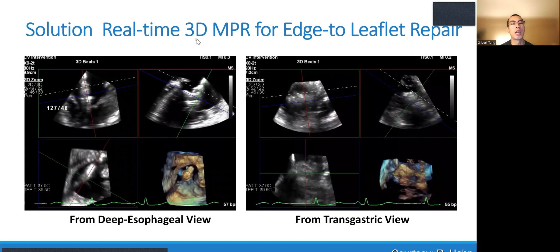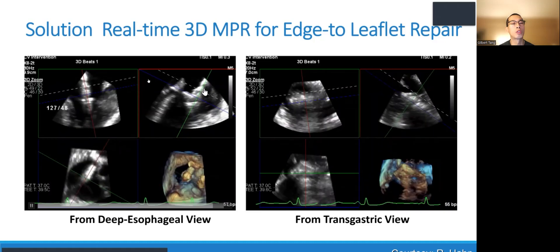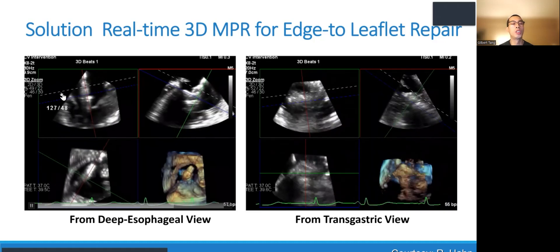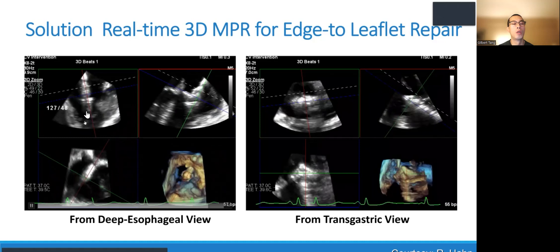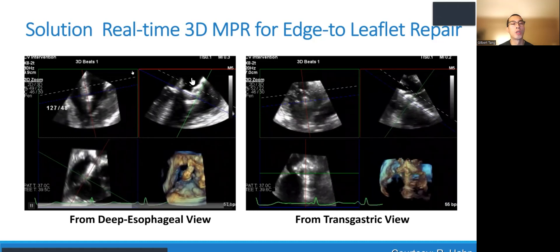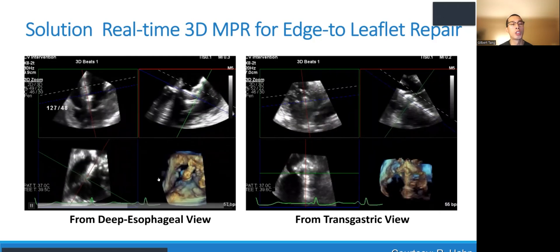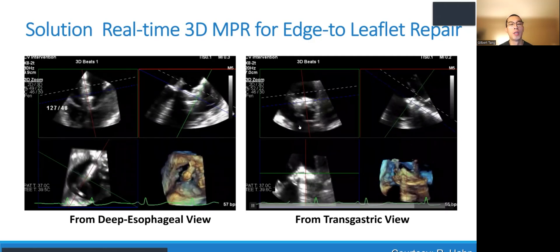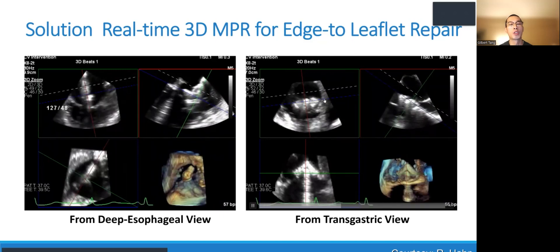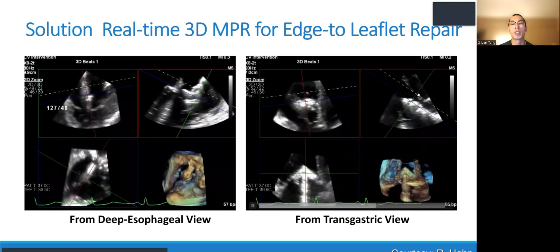The solution is to use 3D MPR for edge-to-edge repair. By doing so, you get all four views simultaneously and work from 2D views that must be high quality. On the top left you see the inflow view; rotating the red box gives the grasping view. You can see the en-face transgastric view showing orientation, and finally the 3D. If your primary view is transgastric, the grasping view is on the bottom left, orientation is on the top left, and the perpendicular view is on the top right.